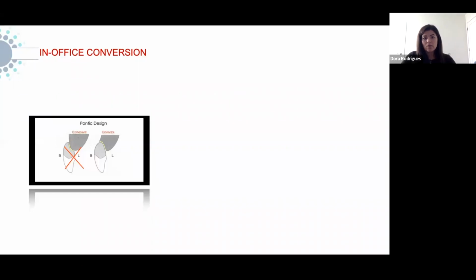So another thing that we have to consider is the Pontic design. And it's not rare, but I had a couple of doctors asking me to leave my prosthesis high water, not touching the gums at all. I do try not to, and most of them I add acrylic. I want to make sure that the intaglio of my restoration is pressuring the tissue and is conditioning the tissue for the final. We want to make sure that we have a convex intaglio in order to make sure that we don't have hygiene problems down the road.